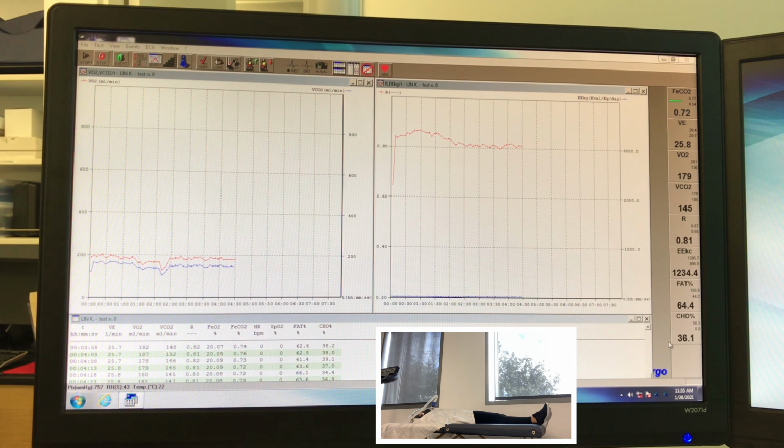I'm getting another warning about the flow rate, probably because our participant is relaxing some and breathing a little more slowly. So I'm just adjusting that to keep the data as accurate as possible. The knob is very sensitive when you adjust the flow rate. So anytime you make a change, you need to wait about 30 seconds to see how that small adjustment plays out.